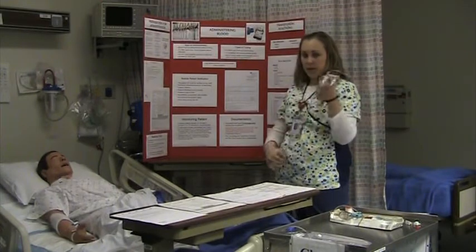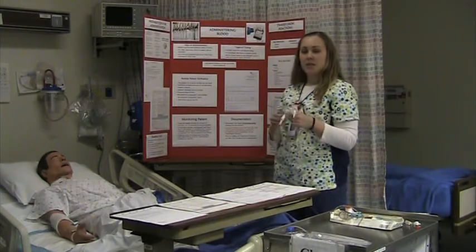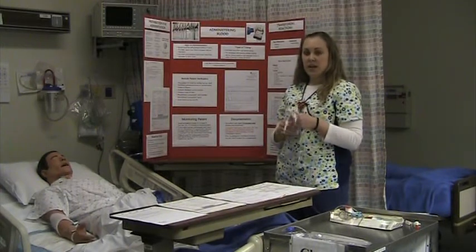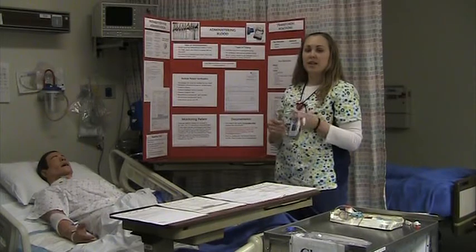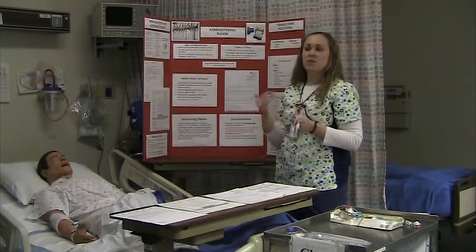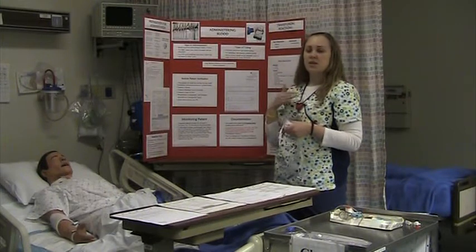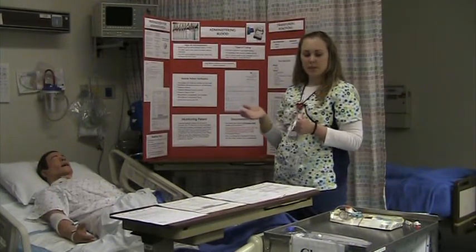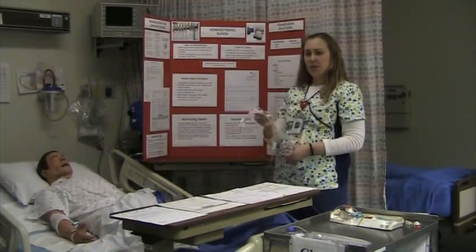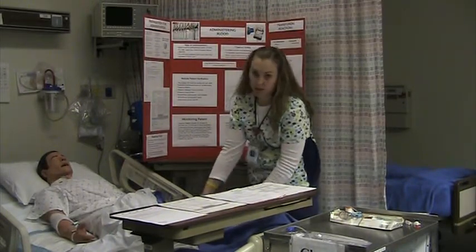This is also our red blood cells tubing that we use. We start slow, and then our policy at Valley Care states that we give it within 2 to 4 hours. So blood is not to hang longer than 4 hours, but not to be given faster than 2 hours. And a lot of times our doctors will specify infuse over 3 hours, so then we go by that. But if they do not specify or write specifically on their order, then it's between the 2 to 4 hour range. Okay? Another thing to remember is that we change the IV tubing every 2 units or every 24 hours to make sure that we don't have any risk of infection, okay?